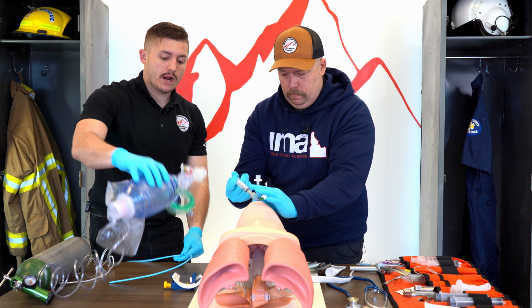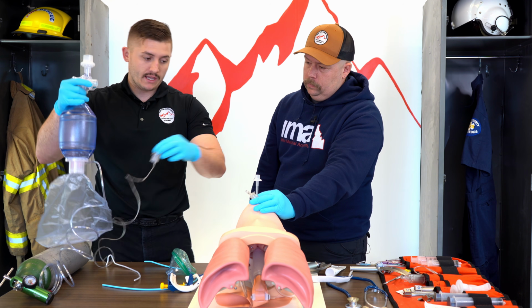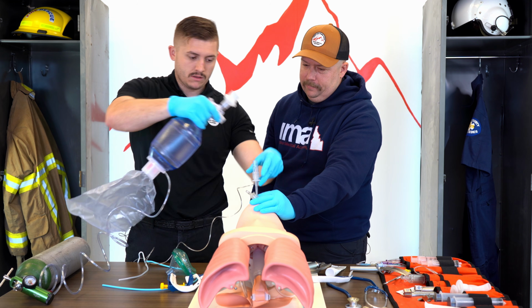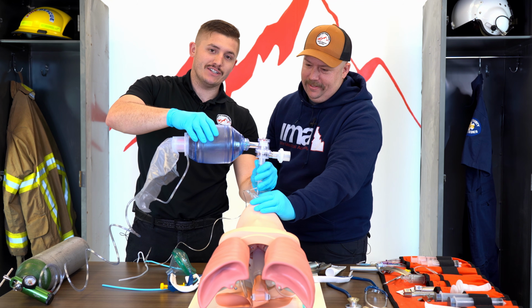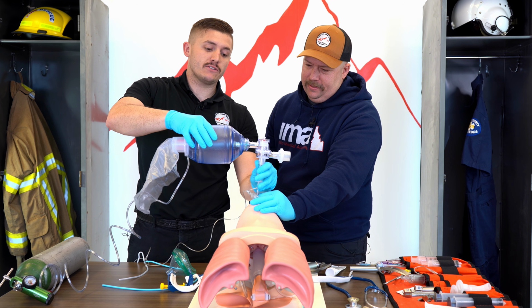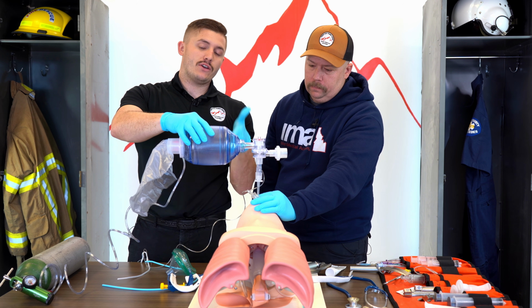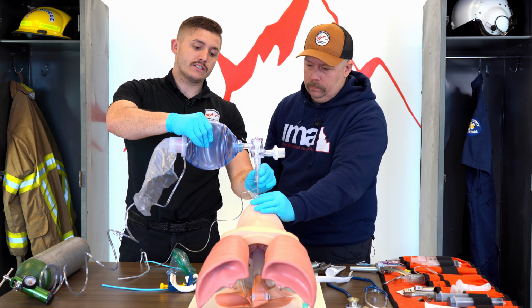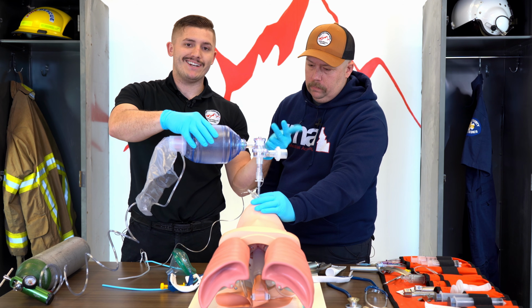So now I'm back to grab my BVM, dropping the mask off. I might place my end tidal. That'll humble you. And now I can begin delivering breaths. You guys can see these lungs fill up so much easier now that that tube is directly going into the trachea, which directly goes to the lungs. So this is going to oxygenate and ventilate our patient so much better than an OPA, NPA, and even an LMA.